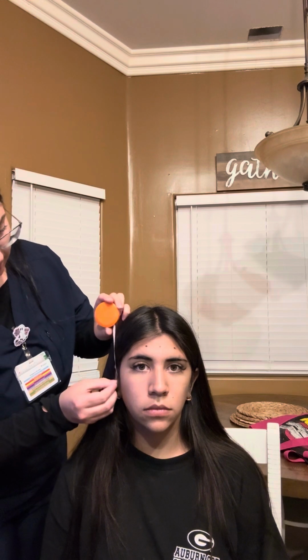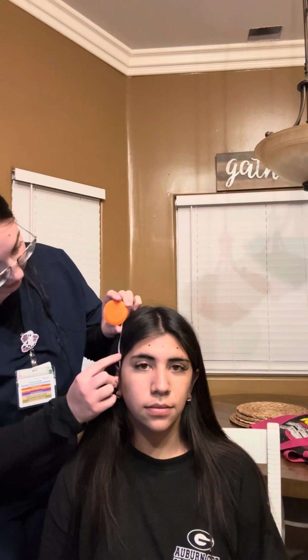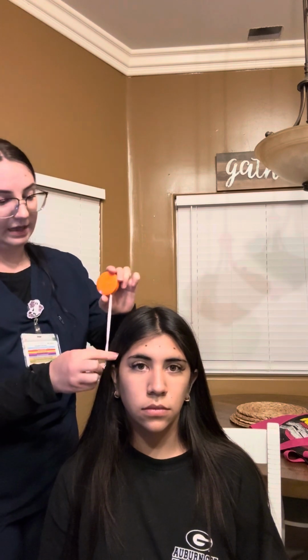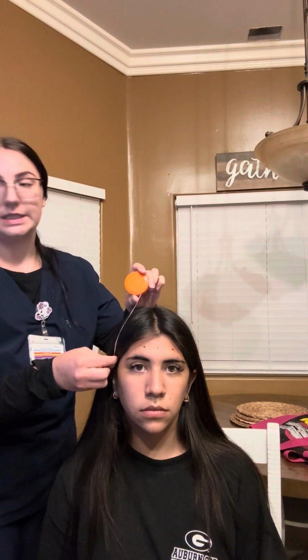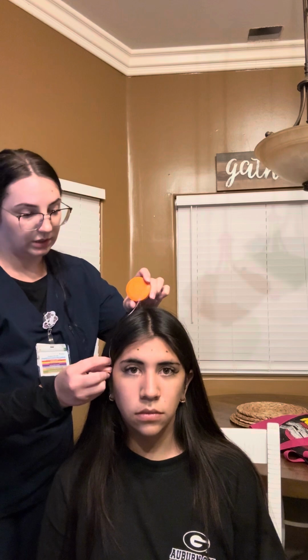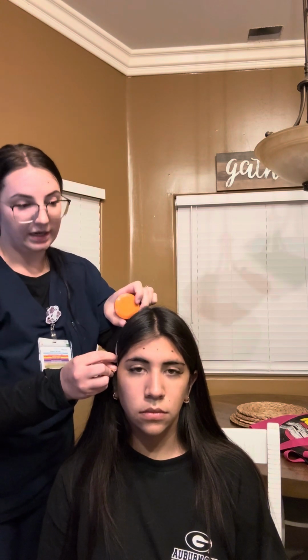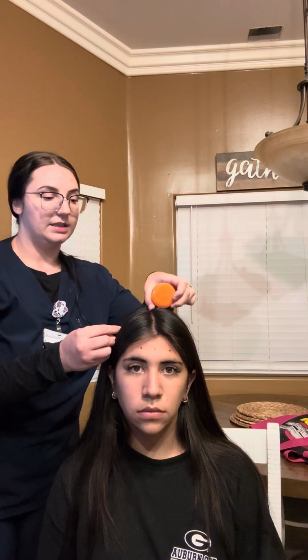Now I'm going to go from T4 on the right side up. Again it's 3.7, because her head is asymmetrical, so it's about right here. Then to get the C4, you do 7.4, right here, and the other 7.4, another 20%, matches up to that CZ.